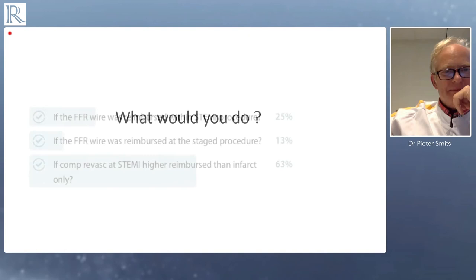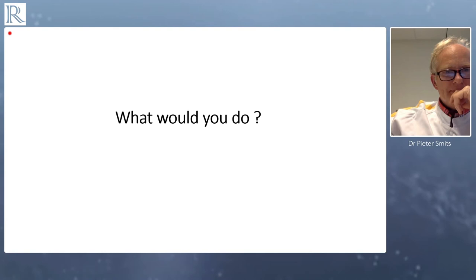It's a case of successful primary PCI — the patient has been treated for the infarct-related artery. It was a quick and easy procedure without too much contrast. Although the LAD does not look very severe to me, it's a very proximal lesion, and we know that almost 50% of the myocardium depends on that lesion. We can come back to the earlier discussion of whether this patient needs to be fixed for the LAD. I'm not sure, but I'm sure we need to know whether this LAD lesion needs to be fixed.